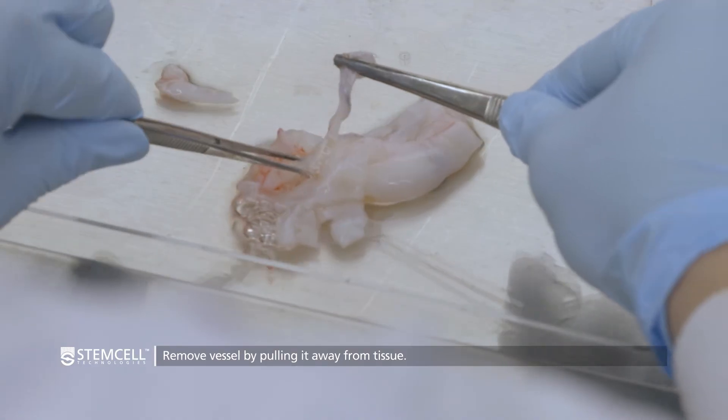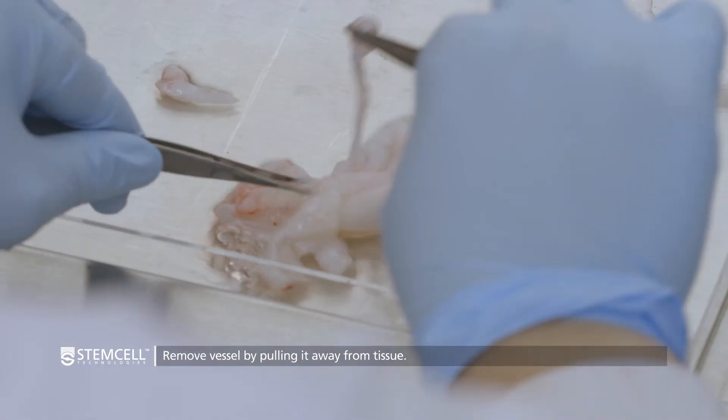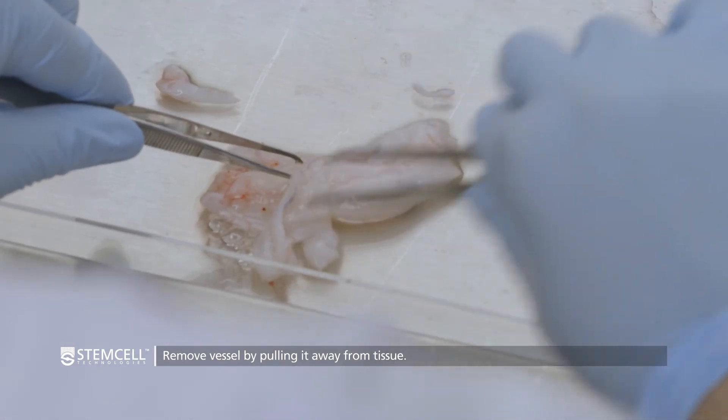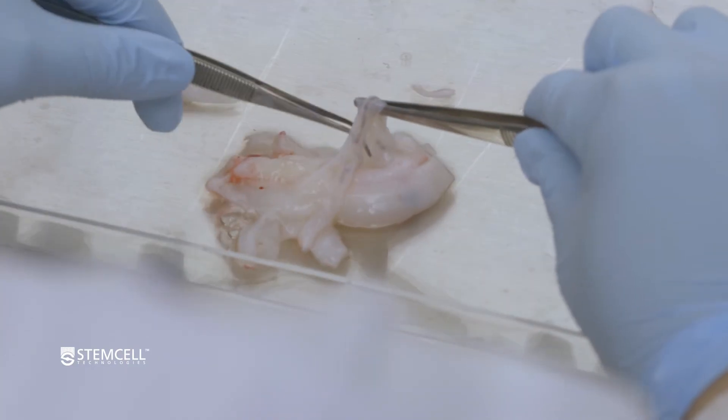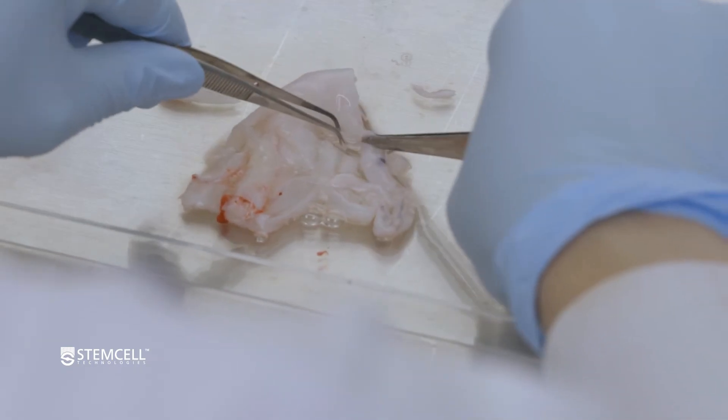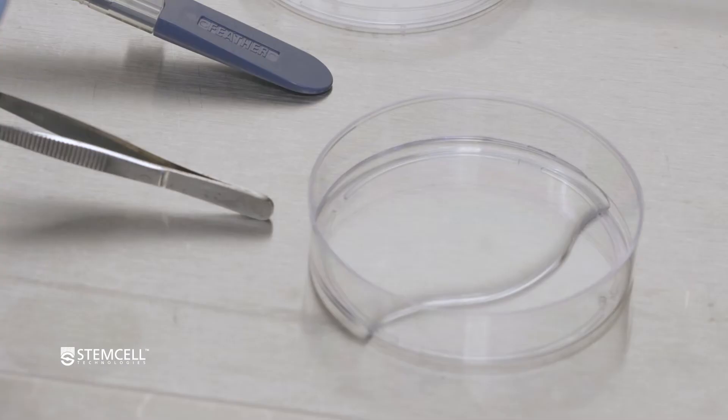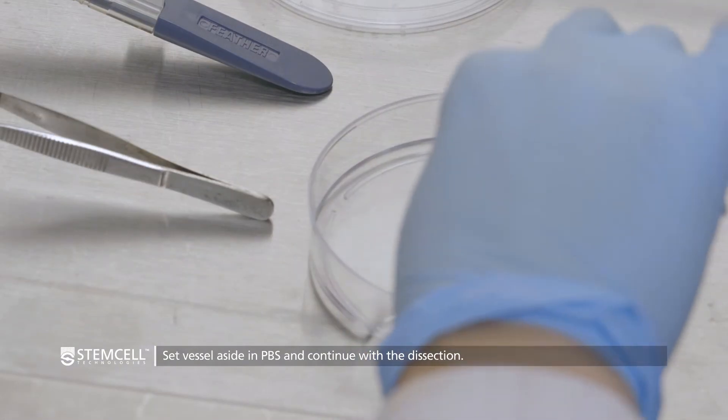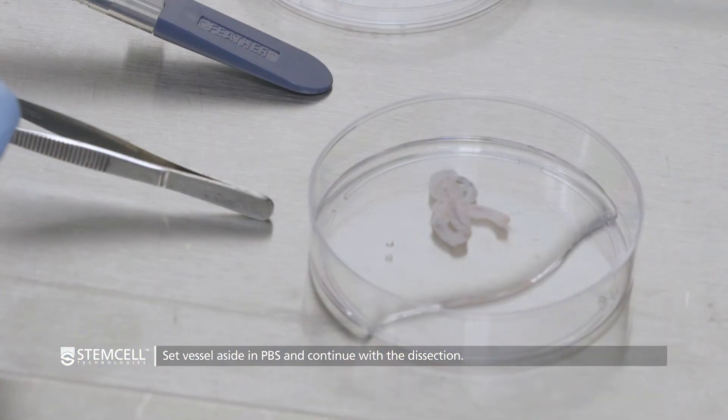Remove each vessel by clamping with the forceps at one end and slowly pulling away from the rest of the tissue. The vessel will be surrounded by a layer of perivascular Wharton's jelly, one to three millimeters thick. Set these vessels aside in PBS while dissecting the rest of the sections.